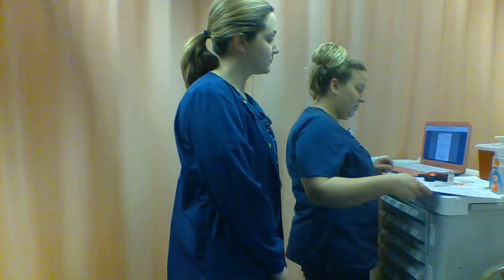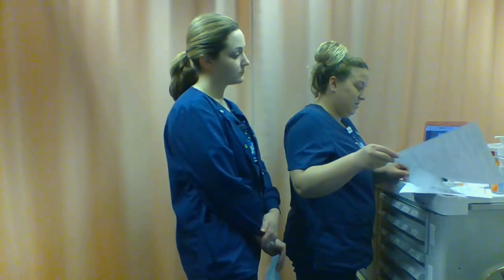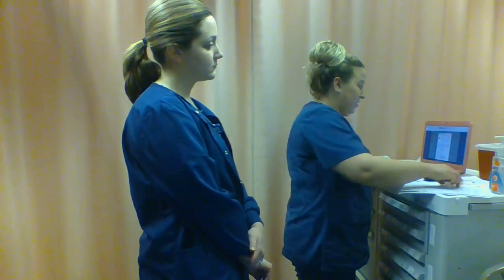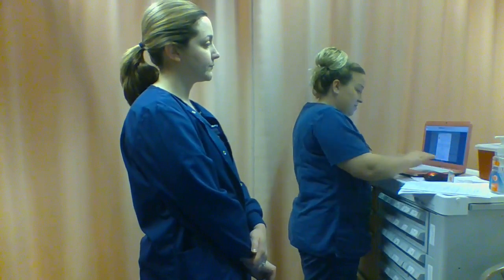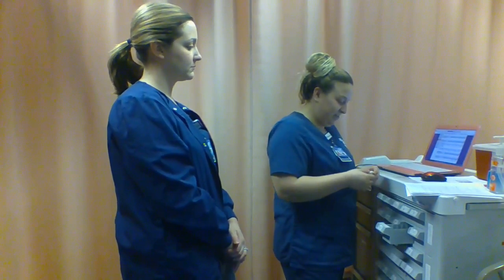Get my alcohol wipes ready. And I'm gonna type in his patient ID. Alright, so we're gonna go ahead and get his medication out of the Pyxis.